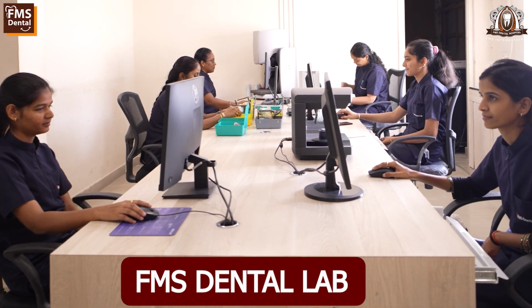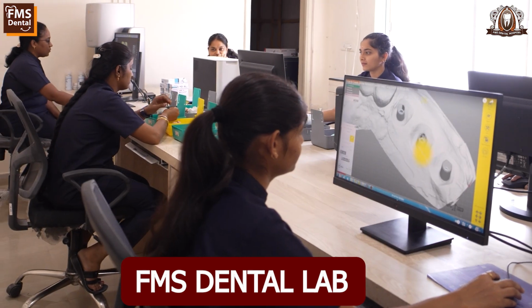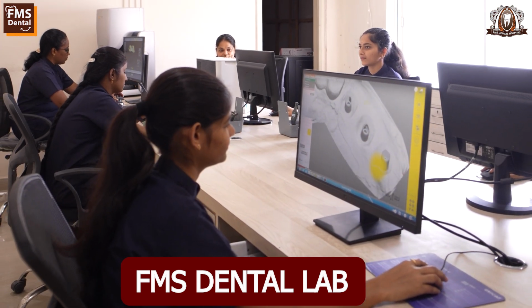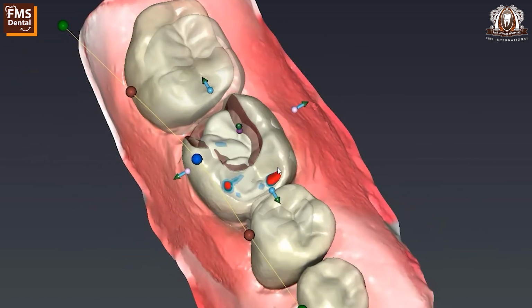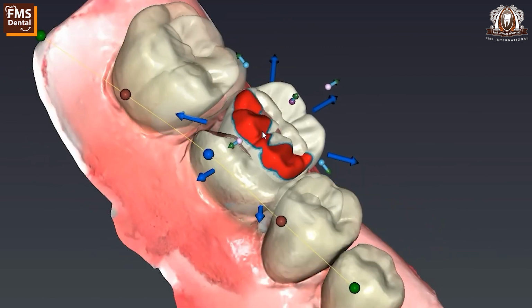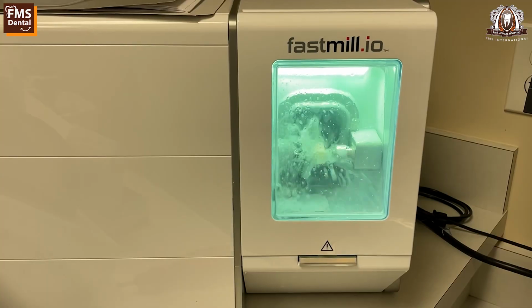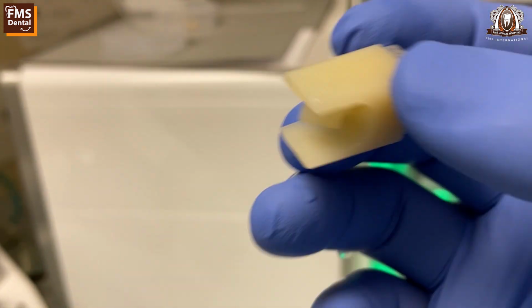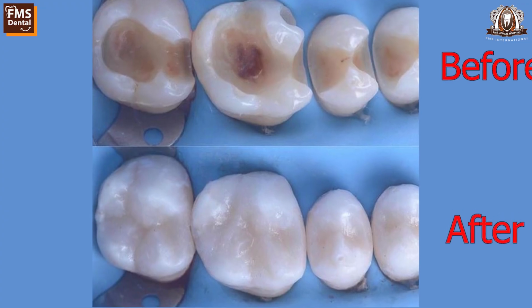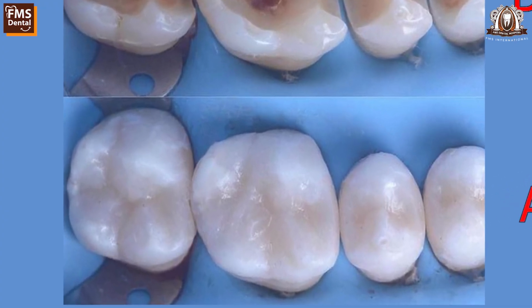It is faster. It can be done in a single visit, especially if the patients do not have time. Because of these digital advancements, we are proceeding more for CAD-CAM inlays rather than laboratory based ones, and even patients are opting for it. The clinical experience and expertise of CAD-CAM designing and milling is required so that the best outcome for the patient is achieved. Definitely, it is a game changer in digital restorations.